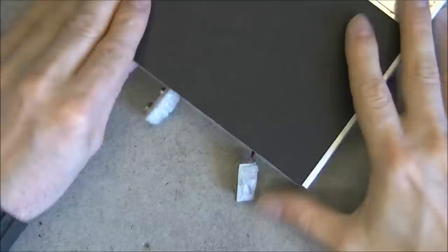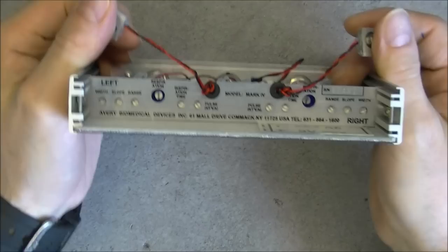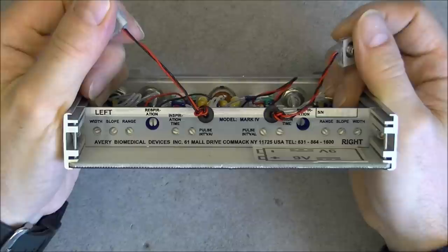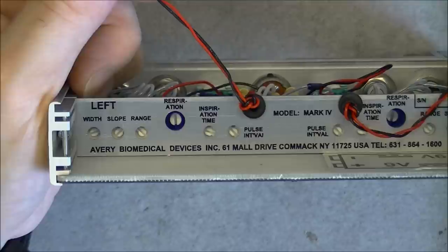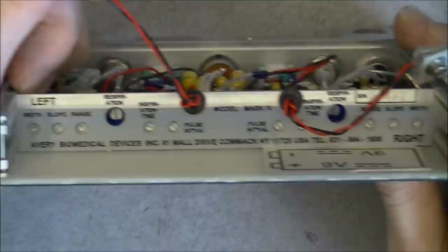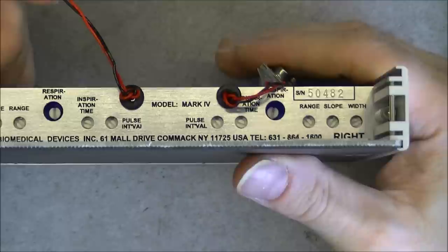On the back here we have, I will first remove this because it will be easier, we have a bunch of information settings. So they are not the user-adjustable settings, they are the practitioner settings probably. You will adjust one time and not modify until the next checkup. You have the information about the company, who made it, and you have a serial number of 50,482.